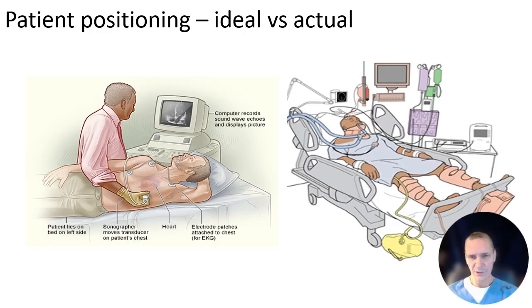A lot of what we'll talk about is ideal positioning and ideal images that you'll get with ultrasound. However, I realize that most often the patients look like this over here, and we don't have ideal positioning. That said, most of what's needed in ultrasound can be done even when your patients look like the image on the right.